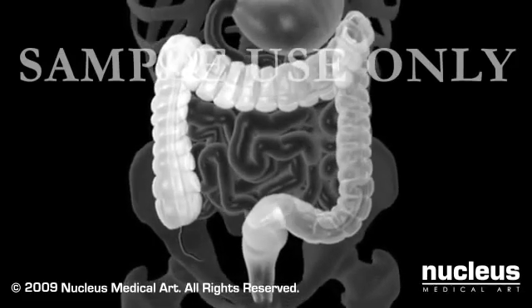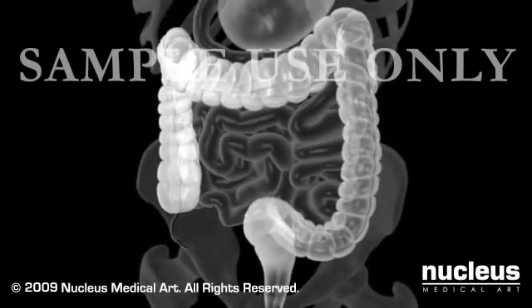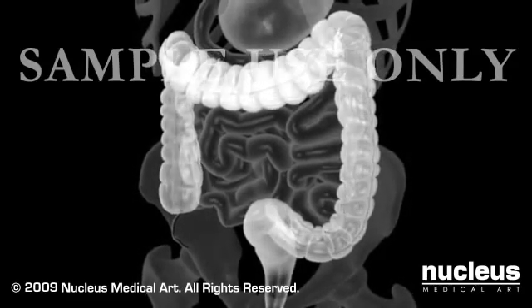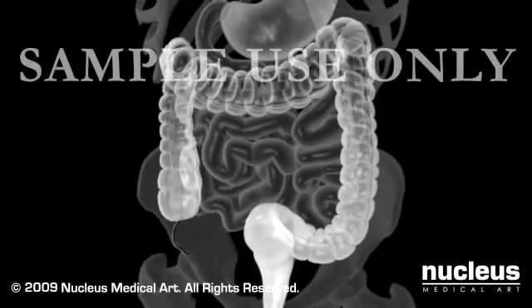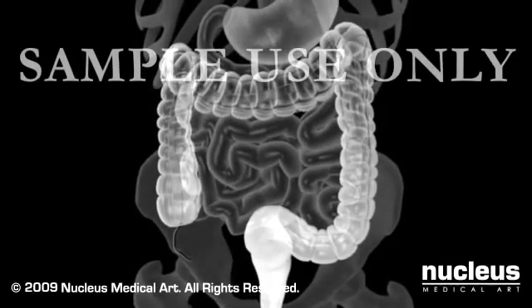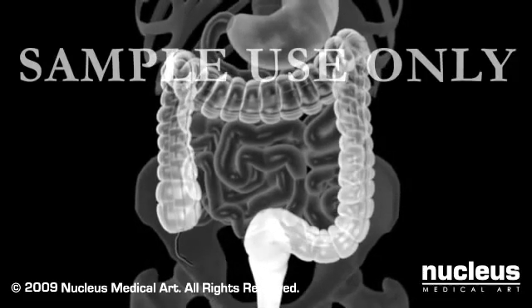After many x-ray pictures are taken, you'll be given a bedpan or taken to a bathroom and asked to expel as much of the barium as possible. A few more x-rays may be taken after you have passed most of the barium out of your colon, because the small remaining amount of barium clearly illuminates the outline of your colon.